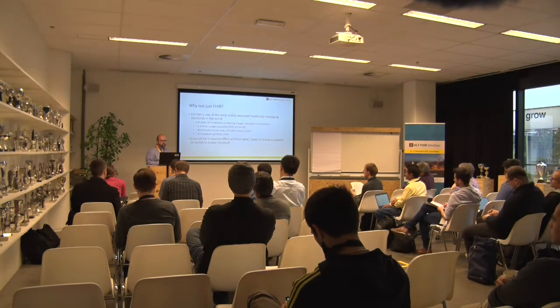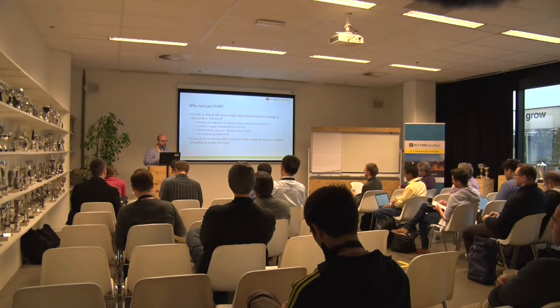2 trillion images are produced annually, 450 petabytes per year, doubling every 5 years. And right now, globally, there are 4.5 exabytes, which are 1,000 petabytes, 1,000 of those gigabytes, right? So it's a massive amount. There's not a lot of value, need, or industry support to be able to switch to a new standard tomorrow, as an example.